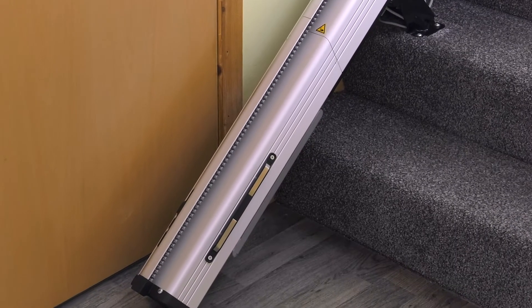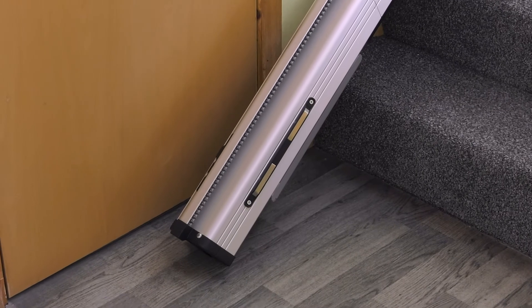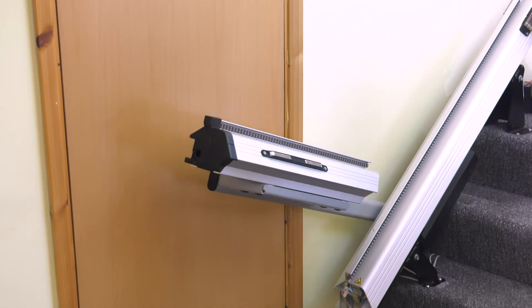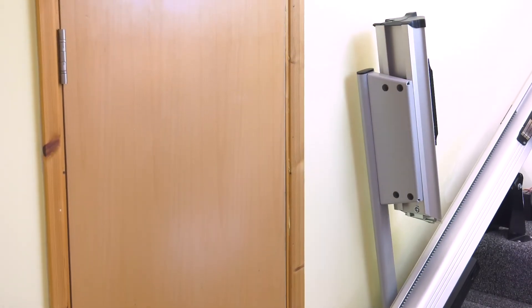If you have a doorway or open hallway right at the bottom of the stairs where the rail would impede access, an automatic fold and hinged rail is used. To avoid a tripping hazard, the bottom section of the rail folds up when not in use.